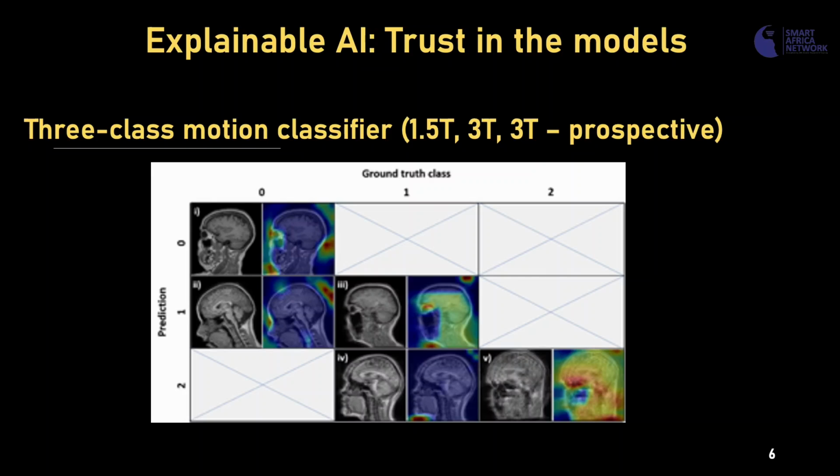And here's our prediction and the ground truth. As you can see, there are these instances where you have stuff outside for no motion mostly. In the cases of motion, it's trying to pick up something where the motion must have occurred.